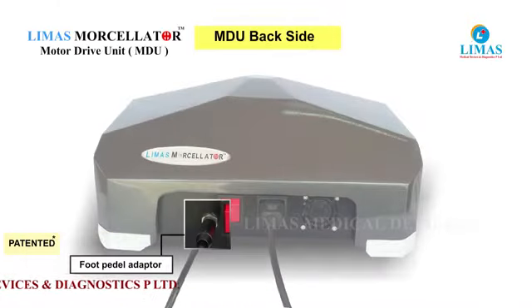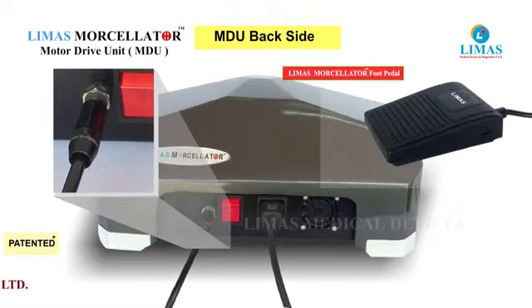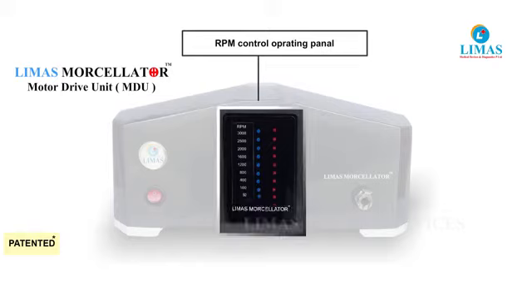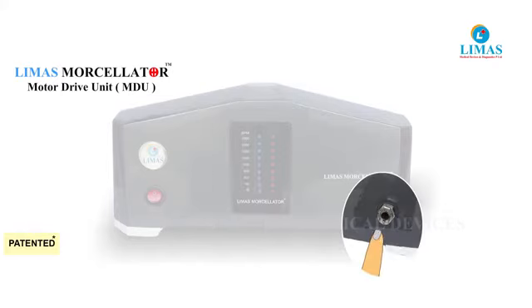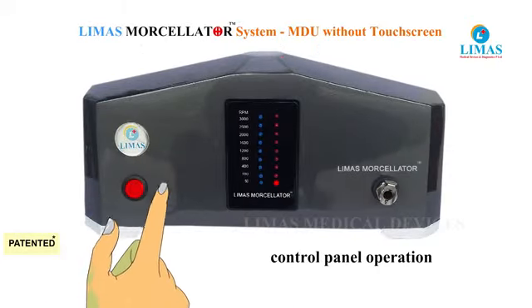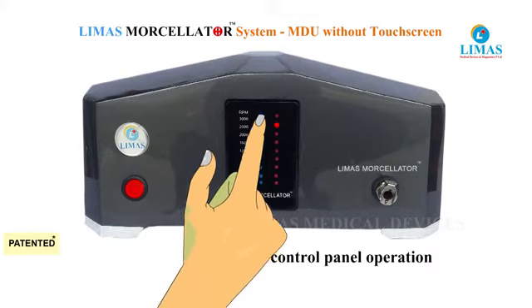The back side of the motor drive unit has a power switch and foot pedal socket. Activation of the cutter blade is enabled by pressing the foot pedal. The rotor cable is connected to the MDU by pressing the locking and unlocking button of the rotor connection port. The speed can be adjusted from 50 to 3000 RPM on the MDU without touchscreen.